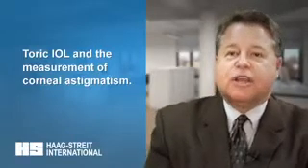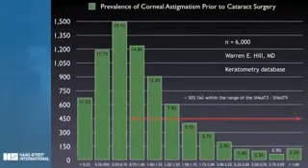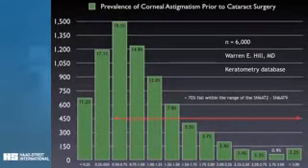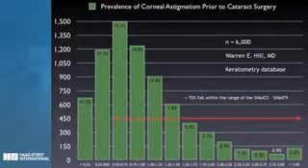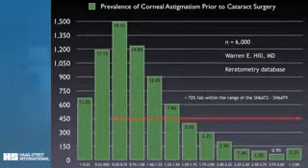First of all, let's talk about the distribution of corneal astigmatism in our patients. Of course, we all remember the 3 diopter astigmat, but it's really the lower value of patients that are the ones that we see more commonly. So for patients who are going to get say the T3 through the T9, about 52% of those patients walk in the door. But if we include the T2, that would be 72% of patients. So for people looking to add the toric IOL to their armamentarium, to have over 70% of patients as potential toric IOL candidates is huge.